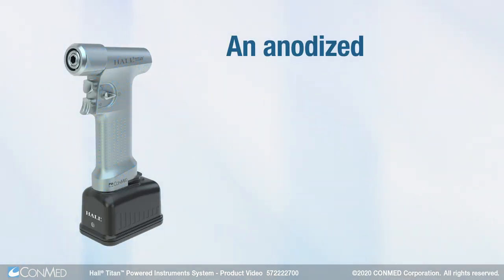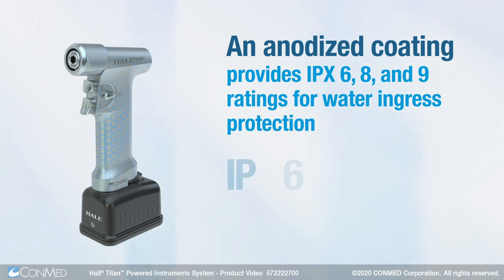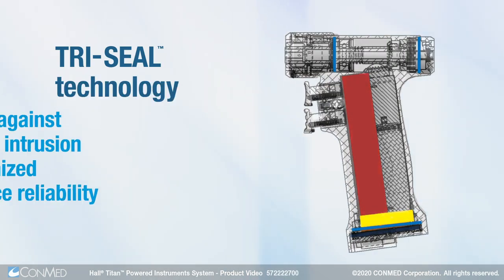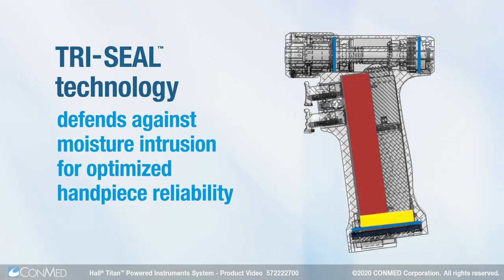An anodized coating provides IPX 6, 8, and 9 ratings for water ingress protection. TriSeal technology defends against moisture intrusion for optimized hand piece reliability.